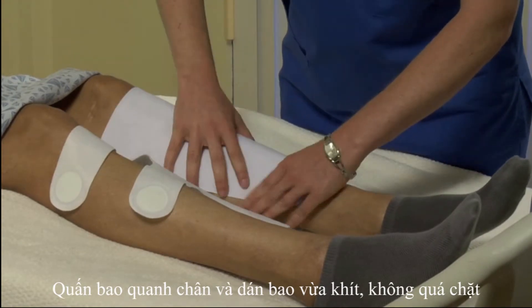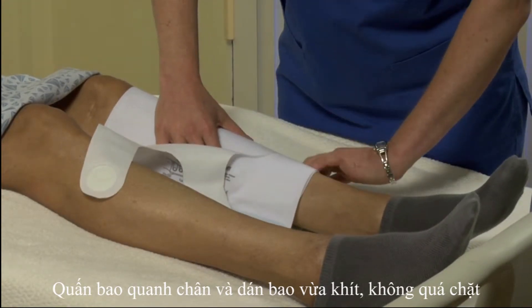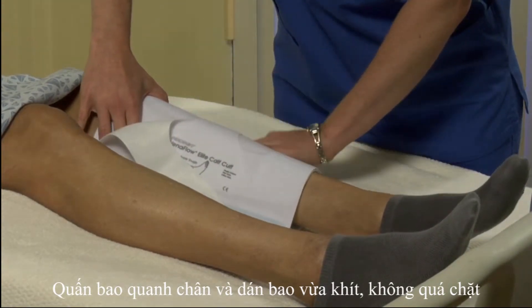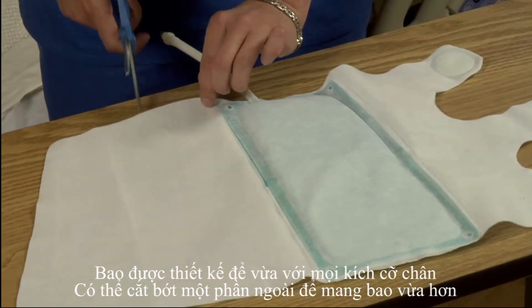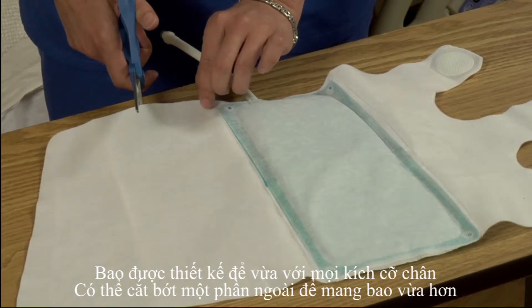Wrap the cuff around the leg and secure the cuff straps so that they're snug, but not tight. The cuffs are one size fits all and may be trimmed for a more snug fit.